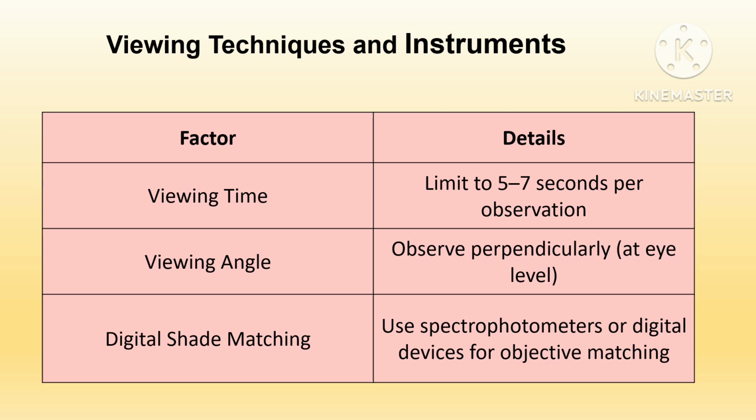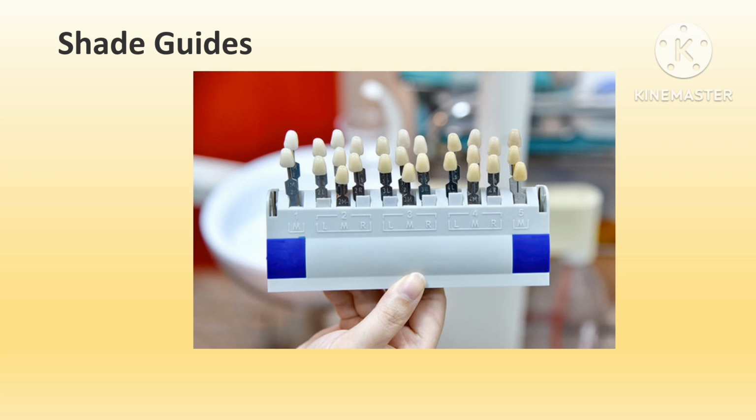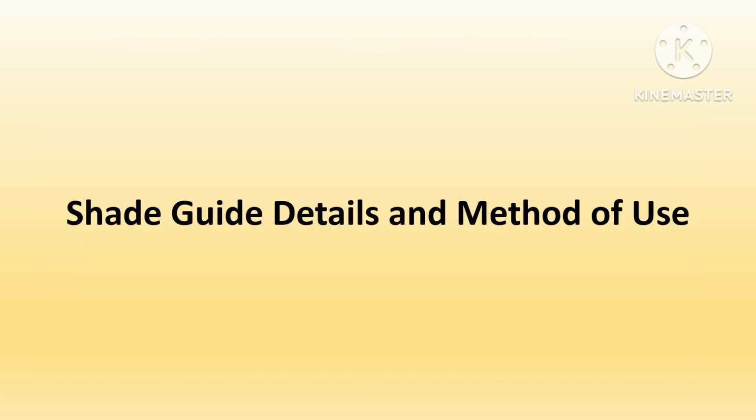When available, incorporate digital shade matching tools or spectrophotometers. These devices provide objective shade references, but remember to calibrate them regularly for accuracy.